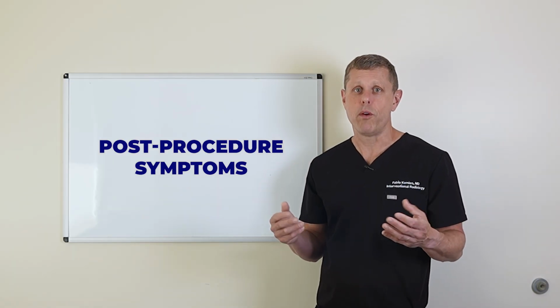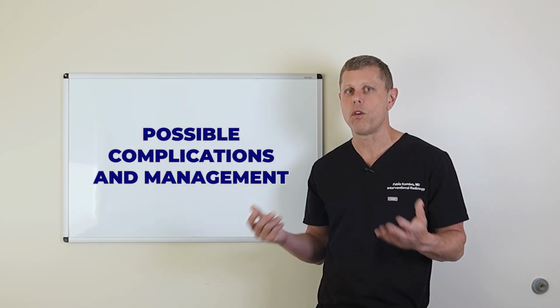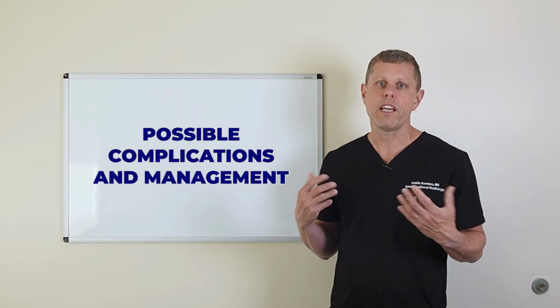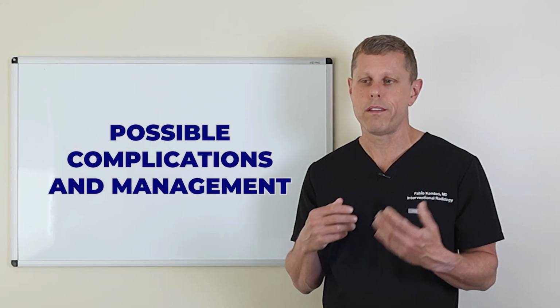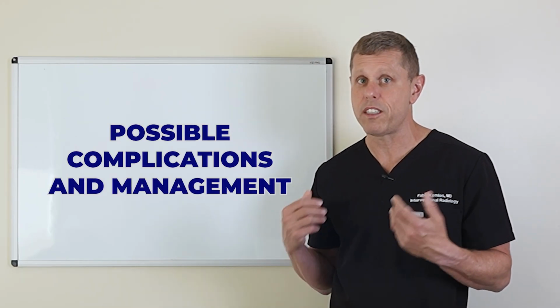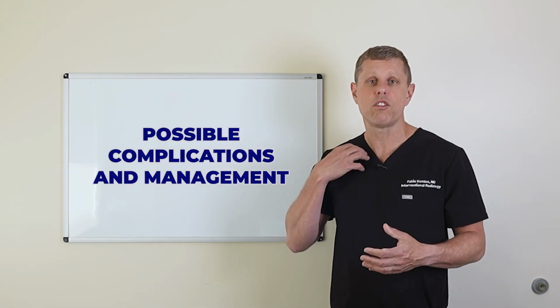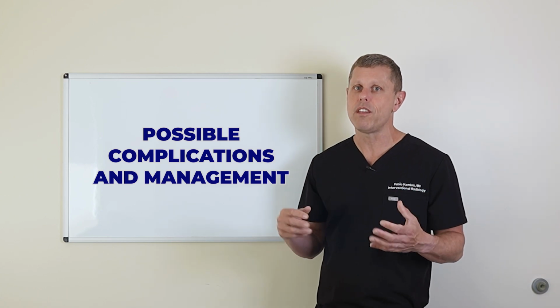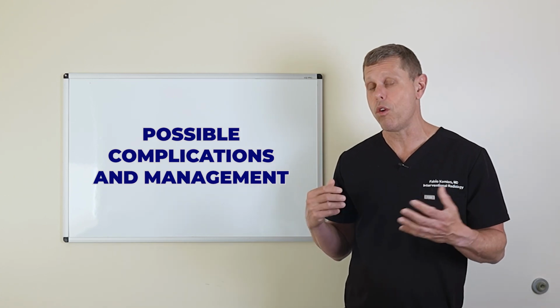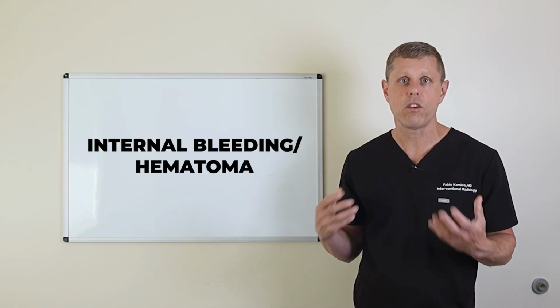So these are the normal things, but what are the possible complications? Like, any procedure has complications. One complication would be a bleeding complication. And like I said, bruising is normal, and we don't worry too much about that, especially if you're not having any pain. But if you're having more and more pain and the swelling in the site is getting worse and worse, that's something that you need to let us know right away, or even go to an emergency room to get it checked, because this could be an internal bleeding or hematoma.